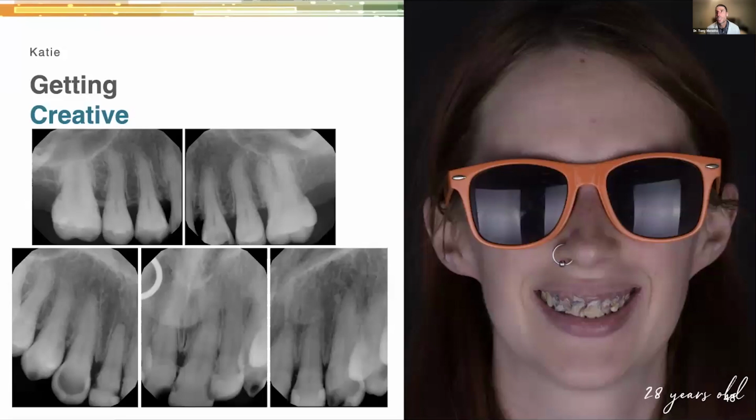What's your single visit CAD CAM workflow time period? Like how long does it take you to do a single visit crown? It depends, to be honest. I build more time. I think mine probably take longer because I am delegating it. So it probably takes a little bit longer, but we book 2 hours for it. Yeah. I would, again, say, I'm sorry.